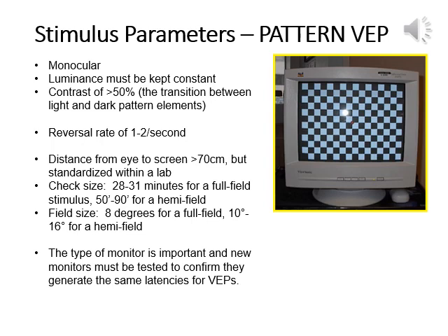The patients must sit more than 70 centimeters away from the screen so that the checkerboard activates just the foveal part of the eye. But the actual distance that the patient sits is standardized within a lab, and for our lab, the patient sits 1 meter from the screen.